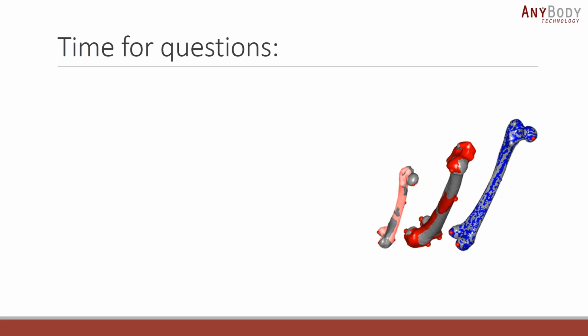We actually worked on something called landmark protocols for some time. But the difficulty with this is that if we have some sort of pathology in, let's say, one of the bones, then the protocol doesn't work. Because of that, we haven't spent much time on finishing those protocols, but we are still working on them. And I think for healthy bones, it's a really good idea. I think the protocols are somewhat available for the lower extremity bones and pelvis. So if you ask us, we could share the information on those protocols. Yeah, great.